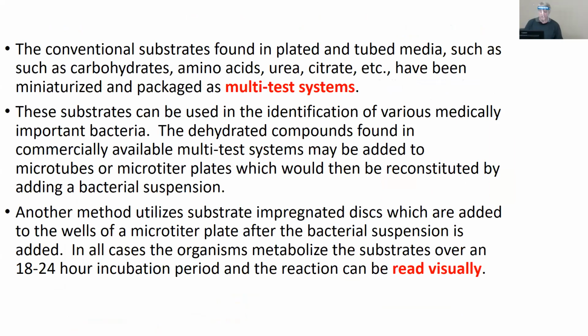So we have conventional substrates found in plated tube media, such as carbohydrates, amino acids, urea, citrate. And y'all tell me if this is part of your presentation. You have these slides, so I don't know how this reads toward the slides exactly, but hopefully it's good. Multi-test system, we have moved you past just the tube testing, right? So we get into the ID panel. We did some impregnated discs through the semester. You guys have some lovely ones downstairs with our Mueller Hinton that we used. Just exactly what I wanted you to see. It's perfect.